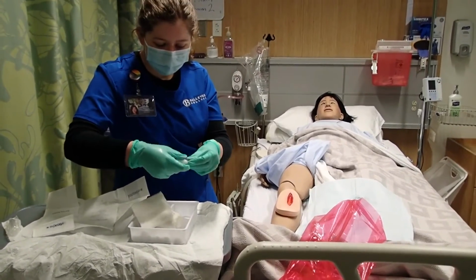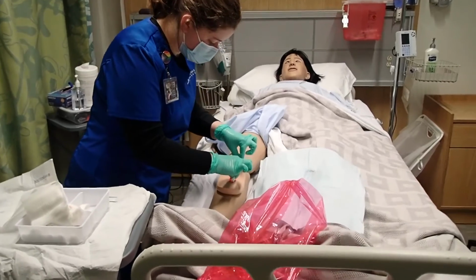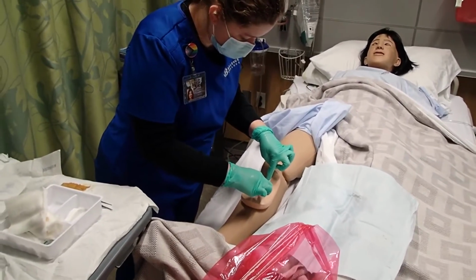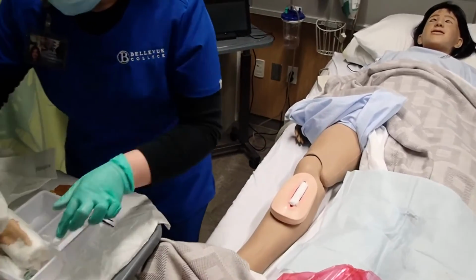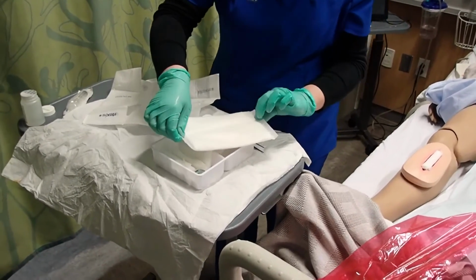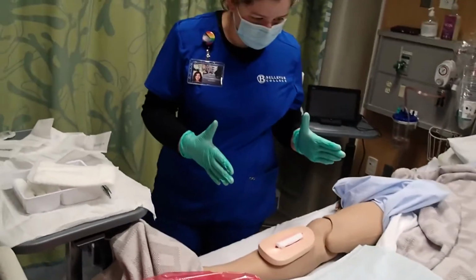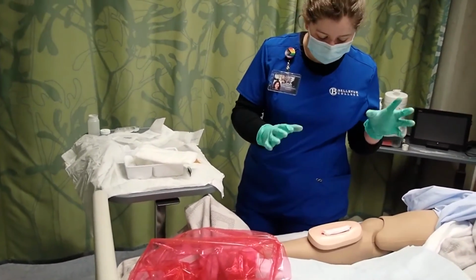You also forgot to do hand hygiene. This is before you put gloves on. I did it too early. Do hand hygiene, then gloves, avoiding touching the outside of the wound. Walk in, do hand hygiene, then after you've done all that, and privacy, then you wipe it down, and after you wipe it down, you do hand hygiene before you put gloves on. Yeah, hand hygiene, gloves. And now we've got a clean wound, we've got dressing for the wound, damp gauze.